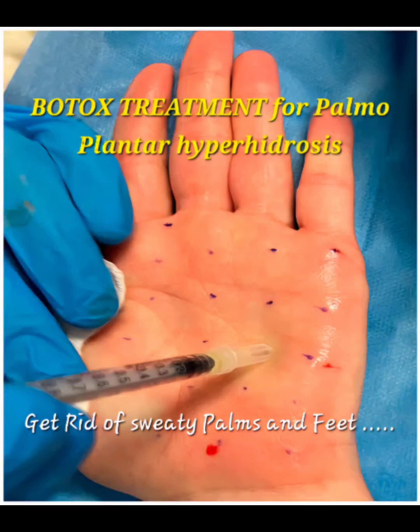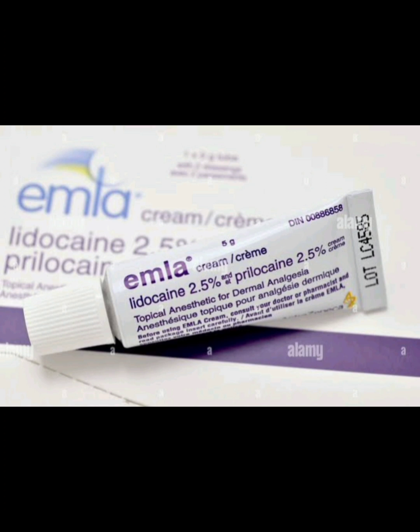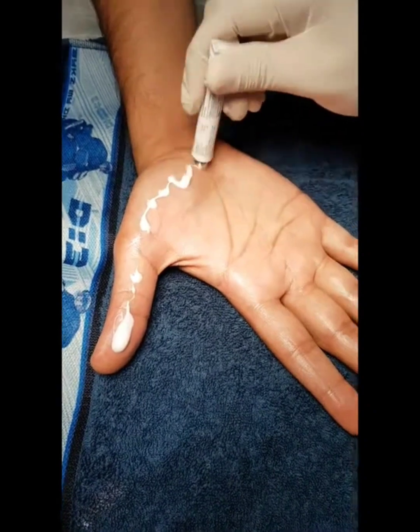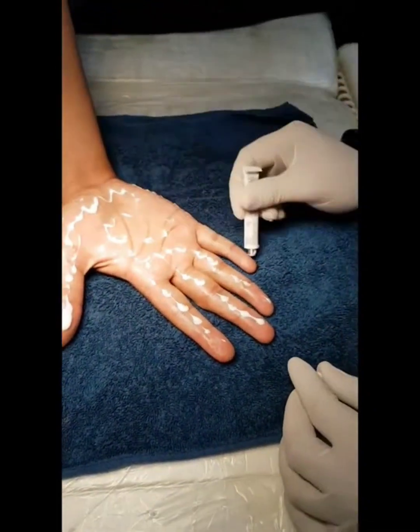Today we will discuss the use of Botox for palmoplantar hyperhidrosis. The first step is application of topical anesthesia. Topical EMLA cream is applied liberally all over the entire palms.